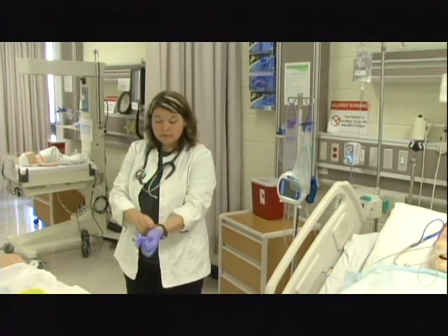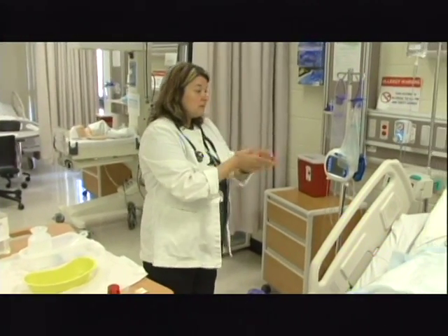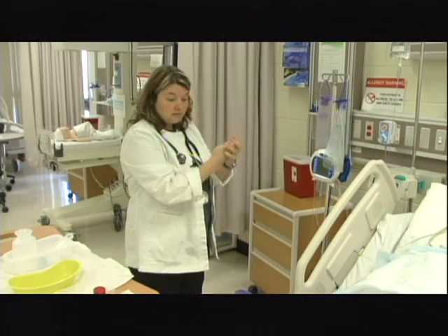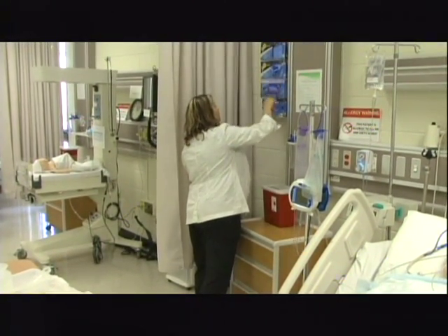At this point, I would recommend taking off the gloves and foaming again, because you've gotten some secretions and things on your gloves, and then you're going to want to come back over and get a new pair of gloves.